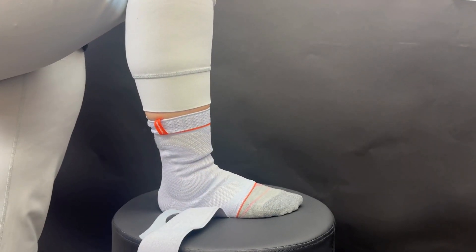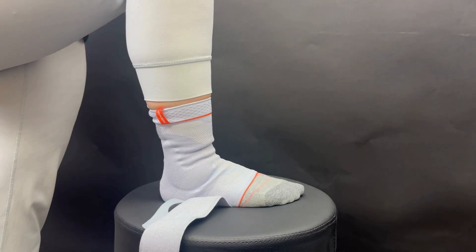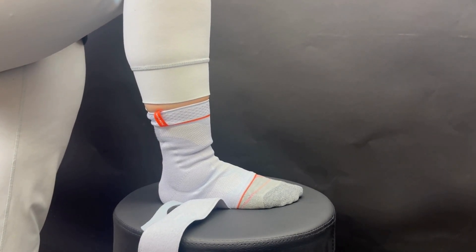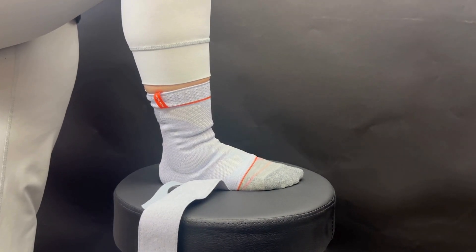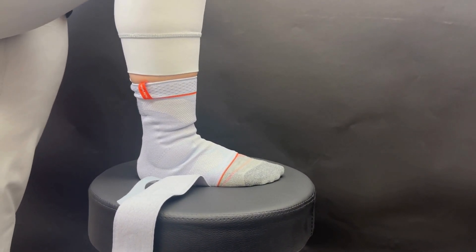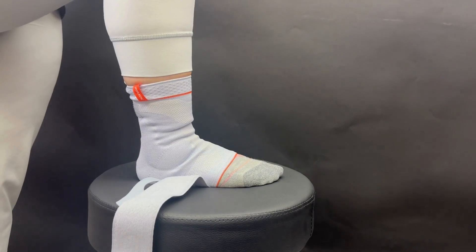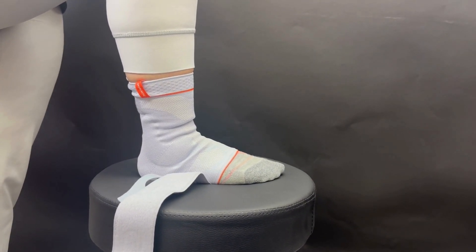Now I'm going to show you how to do up these straps to build the ultimate amount of tension and support in the brace. First, put the brace on either yourself or your patient, then make sure your feet are flat on the floor. This helps build up the pressure as well as keep the foot in its more natural neutral position.